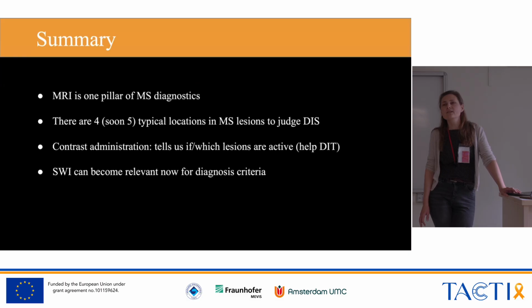But patients, of course, get their yearly MRI scan or their clinically triggered MRI scans out of their regular scheme. Without MRI, you cannot do this. You cannot do it with a CT scan, and you can also not do it without imaging. So our MS patients know the radiology department really, really well.